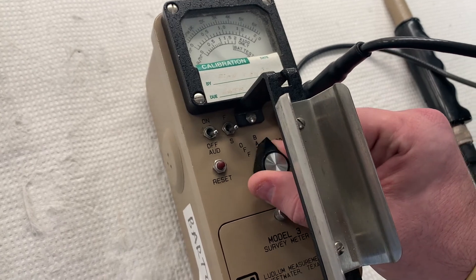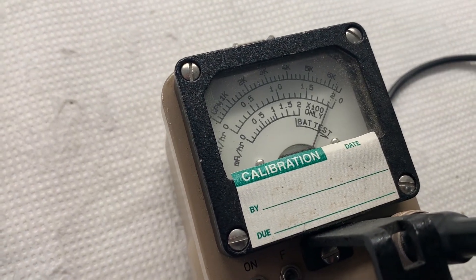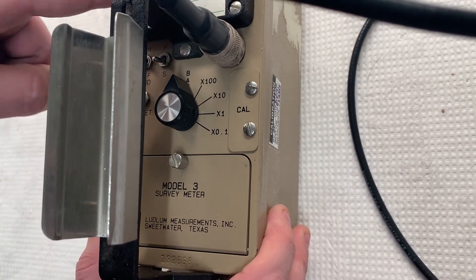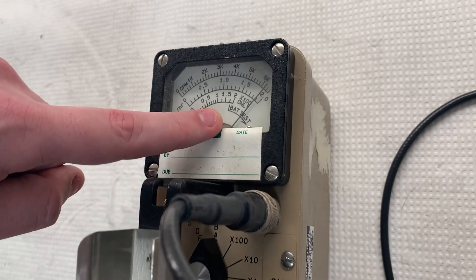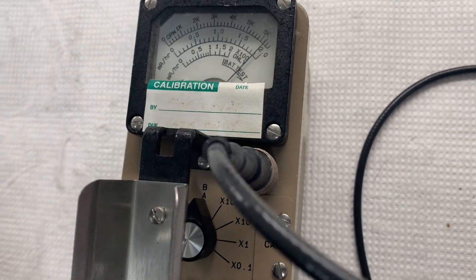Test the battery by moving the selector switch to BAT, or by pressing the battery test button. The needle should move to BAT test or BAT OK on the meter face. If the needle does not move as required, replace the batteries.